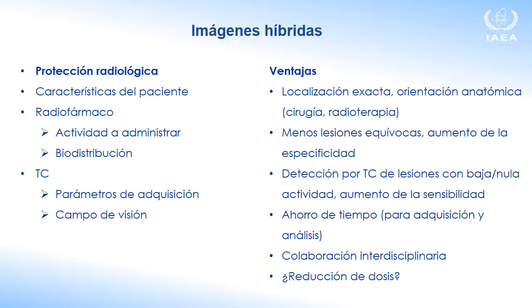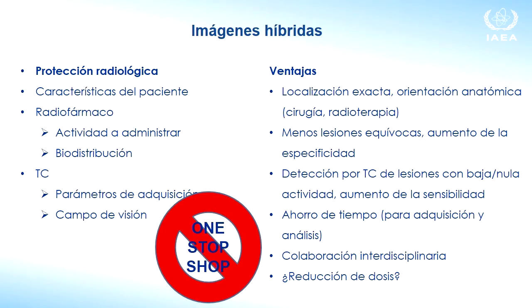You have fewer equivocal findings, therefore you increase specificity. Moreover, you have CT detection of lesions with low or no activity, and therefore increased sensitivity. We have time saving for acquisition and analysis. We have interdisciplinary collaboration with the radiologists, and probably a reduction of doses.